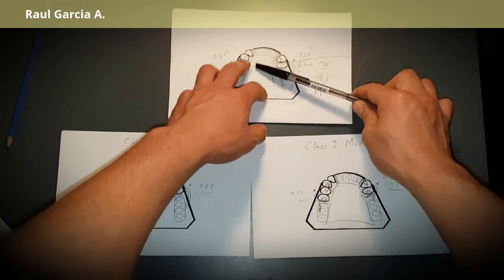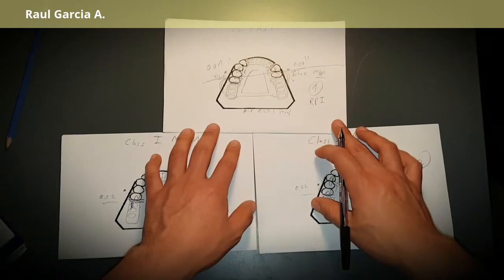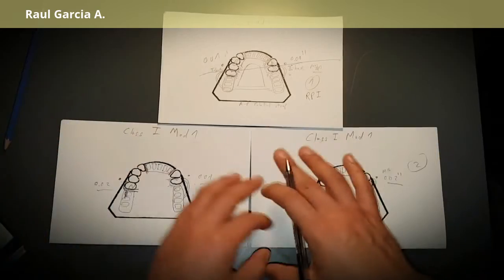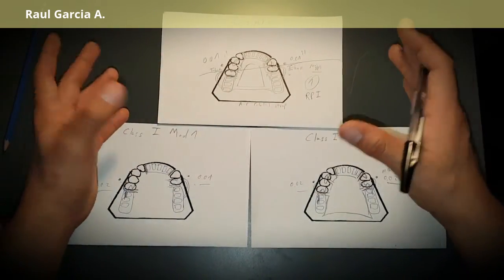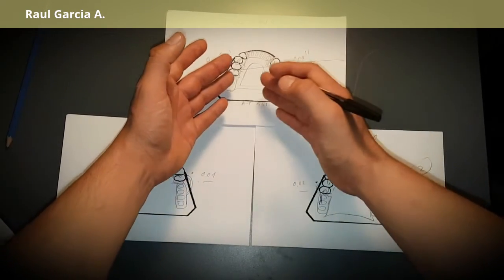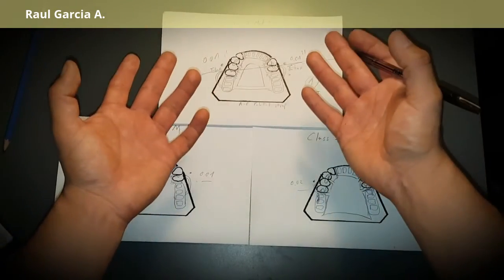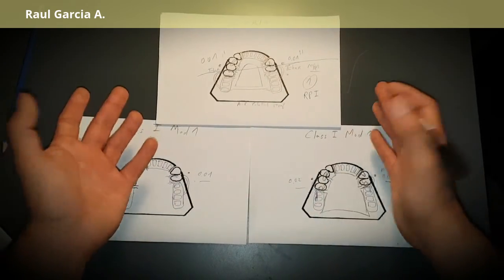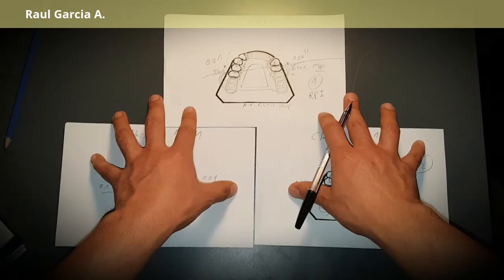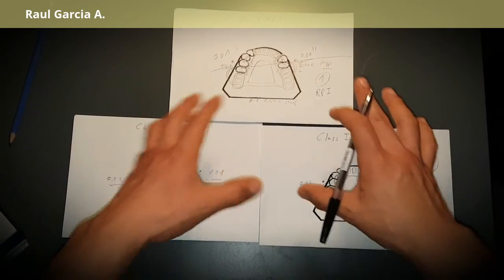That's the rule and the principle. If the fulcrum line were positioned differently, you'd need another clasp type, which we'll cover in a Class II case. For Class I, you know your options — it's a matter of adapting to the undercut position, undercut amount, and choosing the right abutments for indirect retention. More indirect retention won't cause damage, but isn't always necessary. As long as the design doesn't harm the patient, it will work — not ideal, but functional. That concludes Class I; we'll see you for Class II.